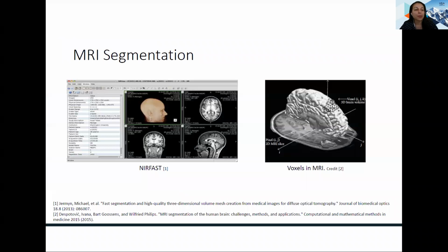Competent diagnosis of MRI imagery requires years of experience. MRI images, in particular, are difficult to interpret, as an accurate diagnosis can require adjustment of a number of parameters and the exploration of different MRI modalities. The automatic segmentation of MRI images offers a unique set of challenges.